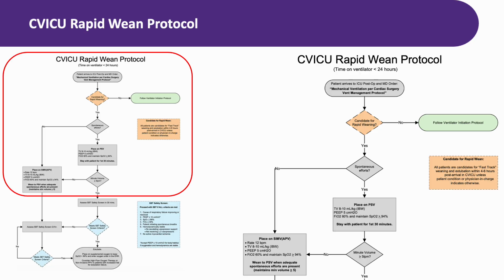Transition to pressure support as soon as adequate spontaneous efforts are present. And just like before, stay with the patient for the first 30 minutes after placing them on pressure support. These are fresh post-op cardiac patients. Hemodynamic shifts are common, and you need to be at the bedside monitoring for their response and ventilator changes.